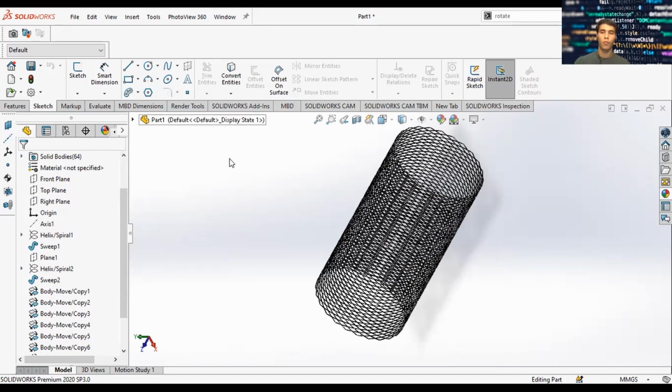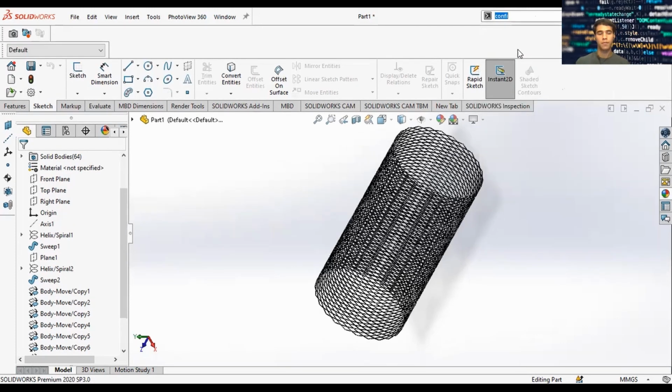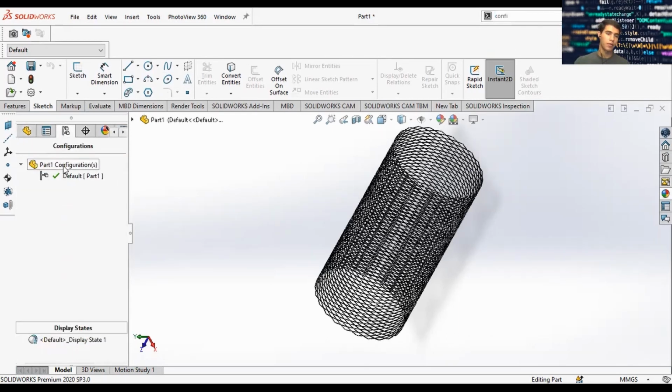So when we referenced that other table, we saw that there are different varieties. So is there a way that you can make different configurations in SolidWorks for those different varieties? And the answer is yes. Just go here to configurations. There are two ways to do it. You can either make manual configurations where you can adjust dimensions of different versions of the same object, or you can make an Excel table and make Excel table configurations. We call those design tables. But it's just better if I show you.